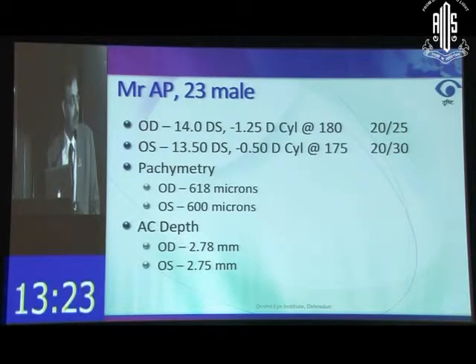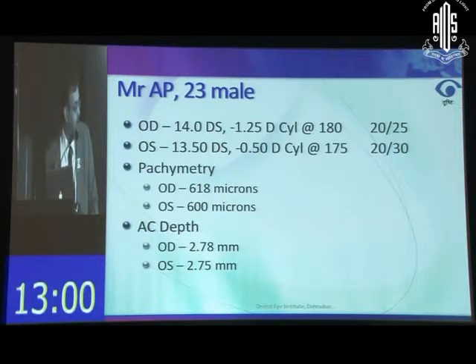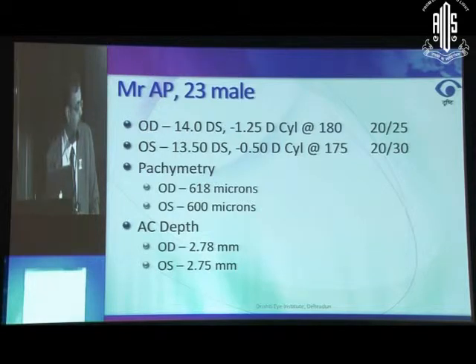Actually, we stick to a 6 millimeter, neither go beyond nor go down. It's always 6 millimeters. In our machine, it consumes about 11 microns per diopter, whether it's a sphere or a cylinder. So -6 with -4 means it's 10 diopters. For me, again, the cutoff is about 10 to 11 diopters. And usually I do not go beyond 130 to 140 microns, irrespective of the corneal thickness. Kumar, you use a different machine, so what's your cutoff, and how much does your machine consume per diopter? It's about 12 or 13.